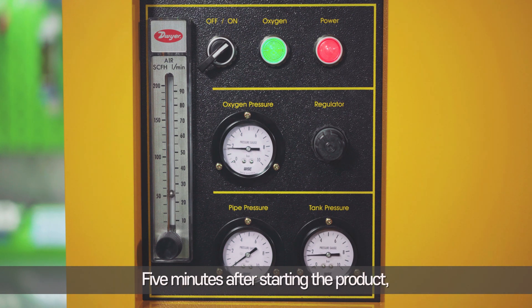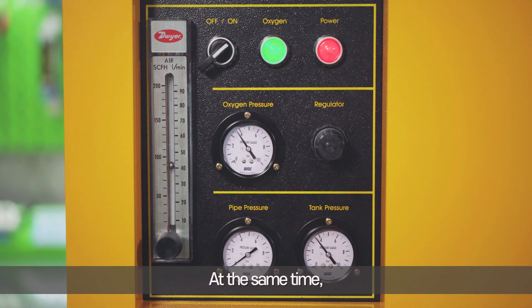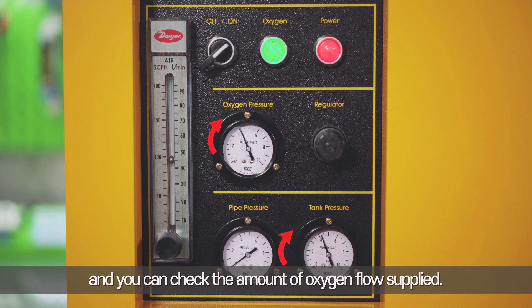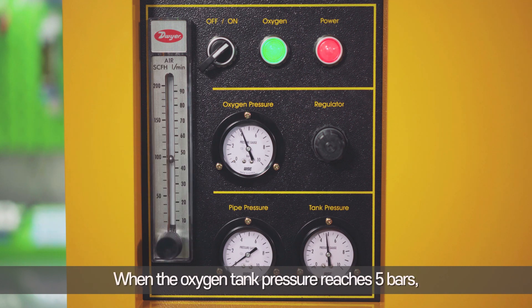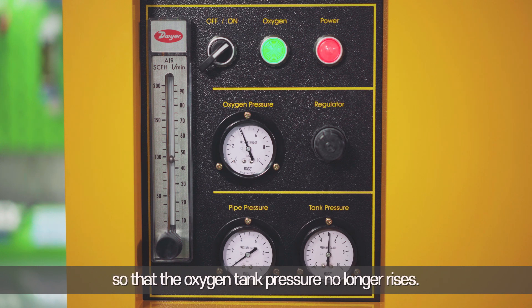Five minutes after starting the product, the oxygen supply starts as the discharge valve closes automatically. At the same time, the pressure of the oxygen tank and the oxygen supply increase, and you can check the amount of oxygen flow supplied. When the oxygen supply pressure reaches 4 bars, 48 liters of oxygen is supplied per minute. When the oxygen tank pressure reaches 5 bars, the pressure regulation valve is activated so that the oxygen tank pressure no longer rises.